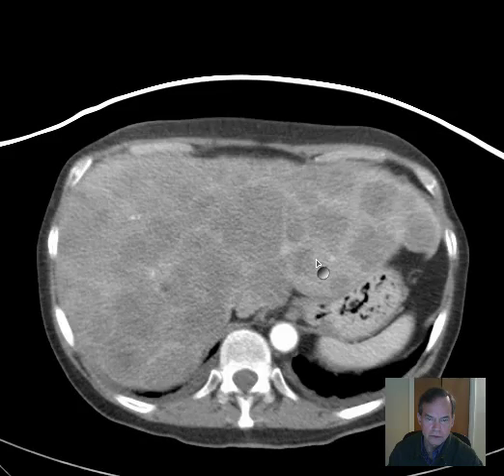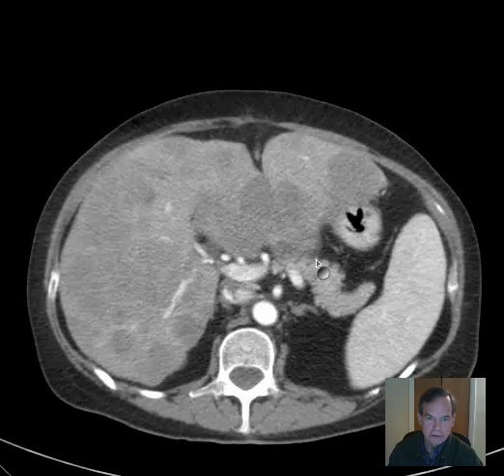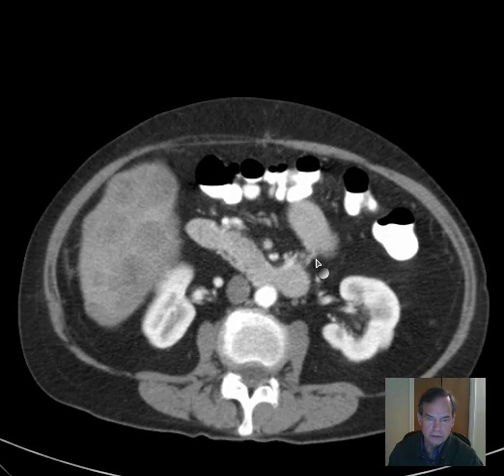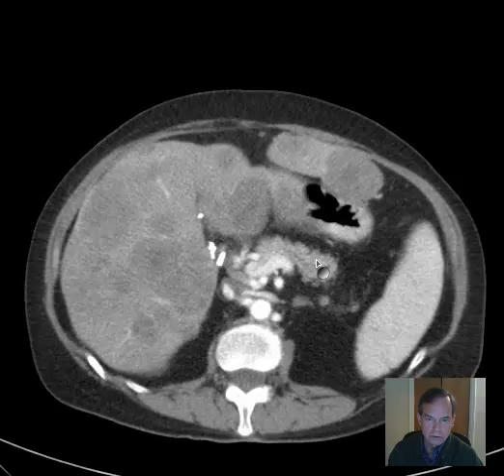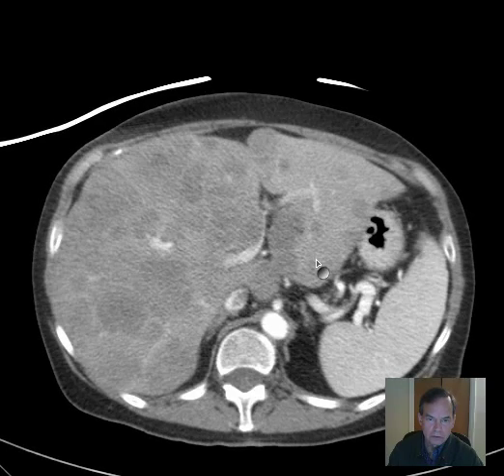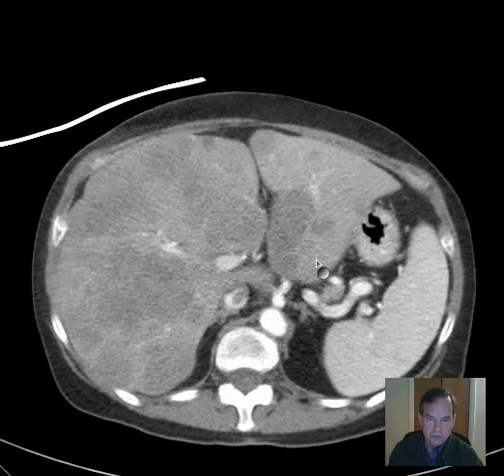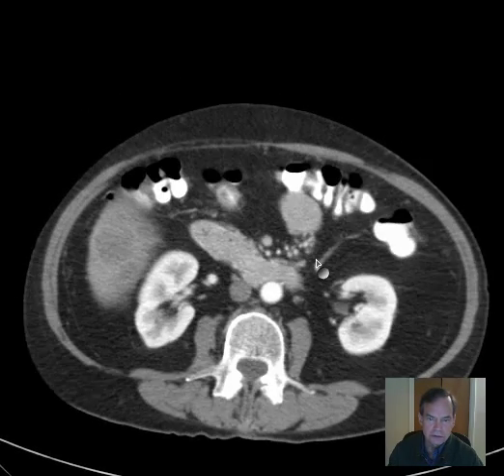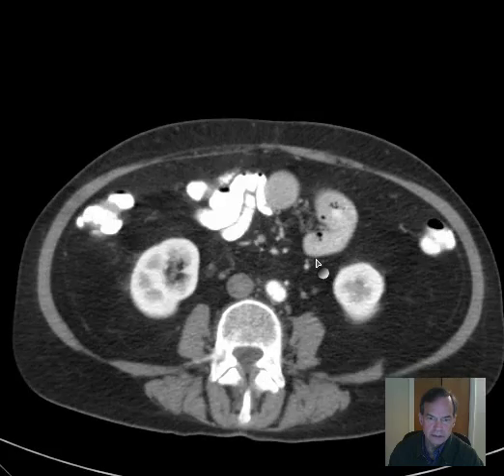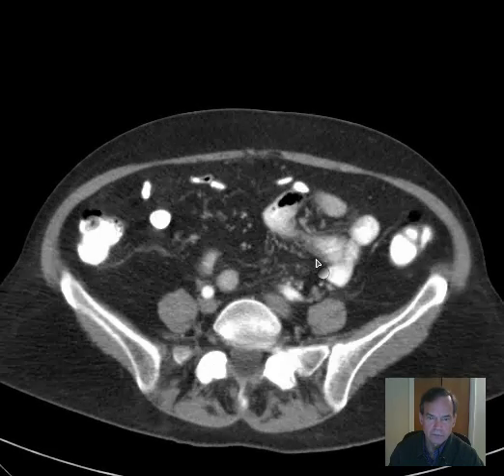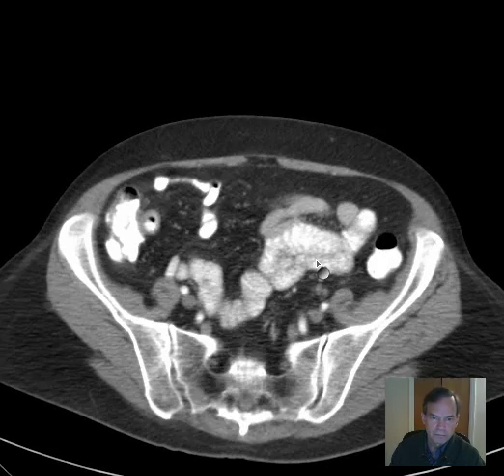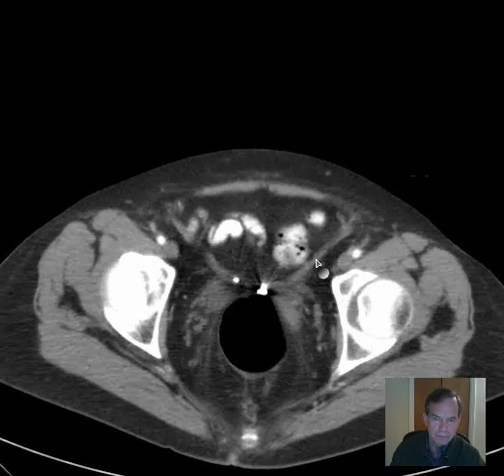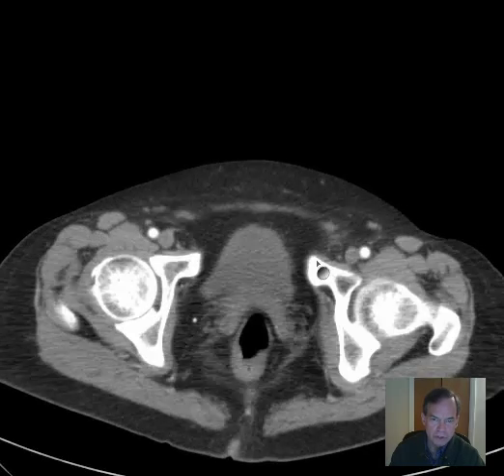Liver, spleen, pancreas, adrenal glands, kidneys, aorta, pelvic structures.